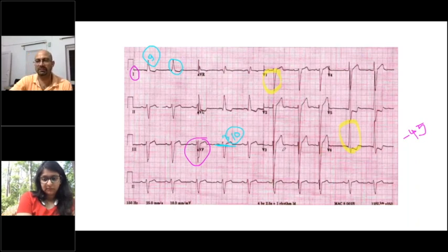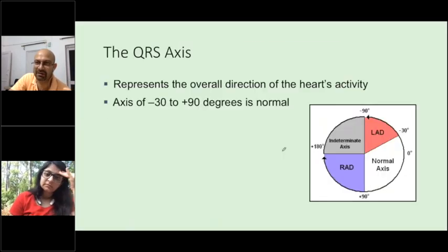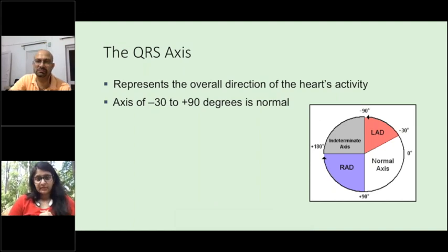Kunal. Sir, I had a question. Yes, I know, Prakhar. We'll come back. Okay, go ahead, Prakhar, ask. So in that particular ECG you just showed, do we have a particular approach to which lead we begin with? Like we begin with lead 2 for the rate and rhythm. So in this we directly went to V5, V6 and V1 to look at the length of the leads, to add up the length if they added more than 35. So do we have a particular approach to that ECG?